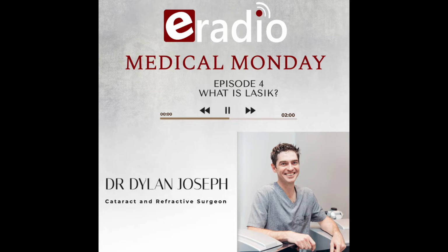Let's start way at the beginning. LASIK, what does it mean? LASIK is actually an acronym. It stands for laser in situ keratomileusis. Now that last word especially is a big one. Yeah. And basically it means you're reshaping the surface of the cornea using a laser pulse. And that laser pulse is what we refer to as an excimer laser or excited dimer laser. It actually uses a combination of noble gases, which then emits light rays in the ultraviolet spectrum.